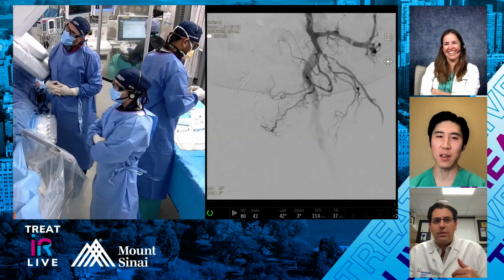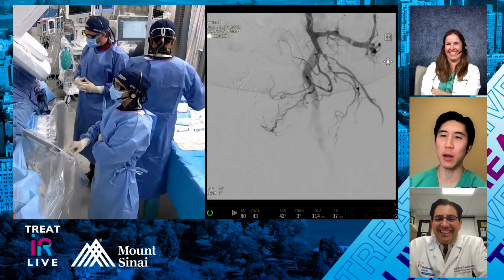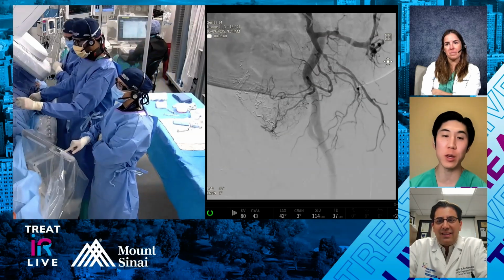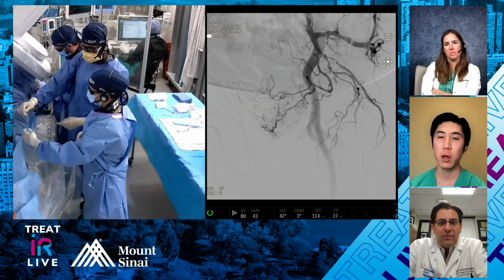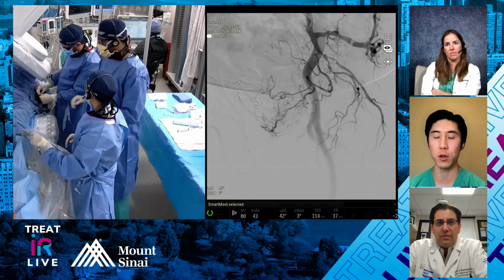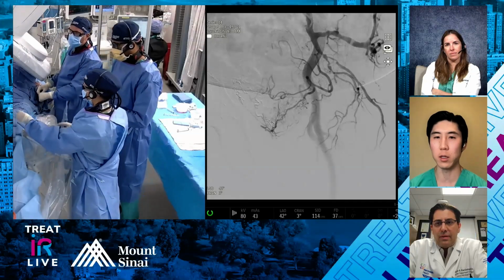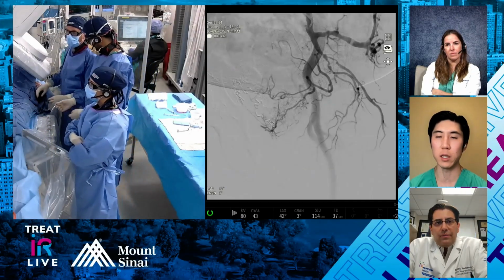Well, yeah, you are old and I'm younger. So I think for those who are younger and starting out in this, using cone beam CT is probably a smart way to go. Me personally, I'm kind of like Aaron. I use it more as a troubleshooting technique. And some of my patients travel from afar, so it's not always feasible to get a CTA ahead of time. So a lot of my patients don't have CTAs coming in.